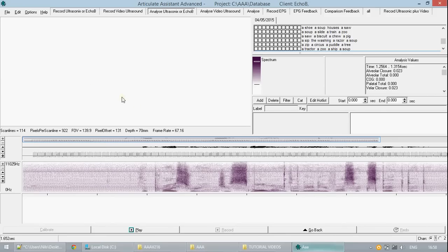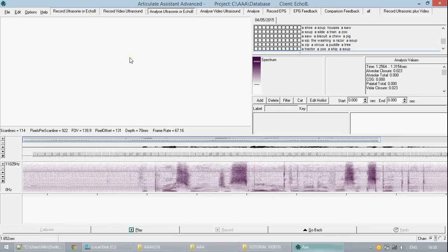Right now we are looking at the tab analyze ultrasonics or echo B. We had selected the data previously in the record ultrasonics or echo B tab. We are using the same demo data in this tutorial as we used in the previous.